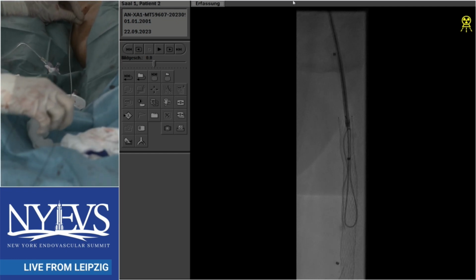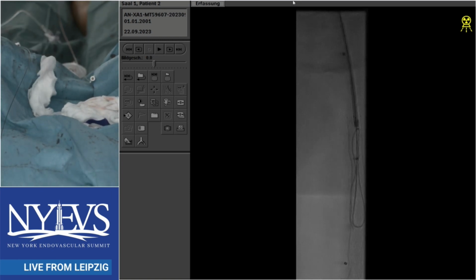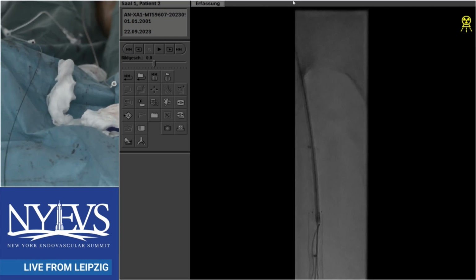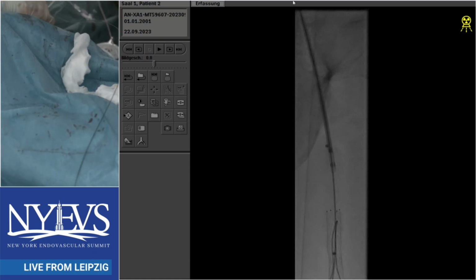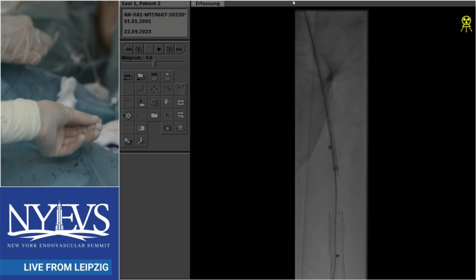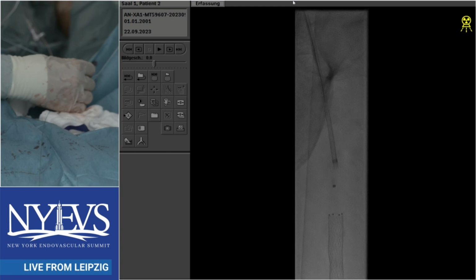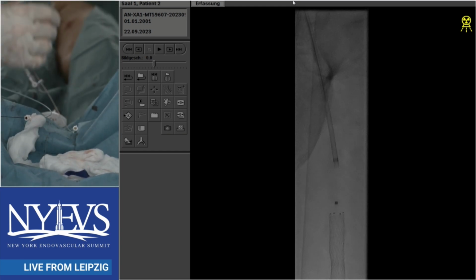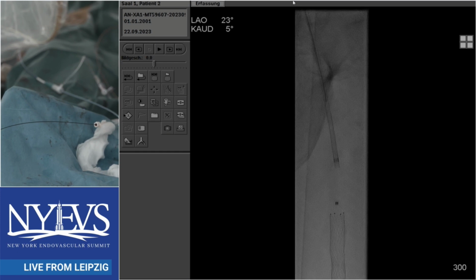What is important, in my opinion, is also to understand why this stent occluded. Maybe if I see a couple of fractures, I don't know if they are so important to create an occlusion of the segment, but this can also prevent the intervention during the follow-up of the patient. Also, would this be a good case for a PQ bypass? It could be. And remember that all you need is flow to heal, perfusion to heal, and healing time is different from rest pain or claudication duration.